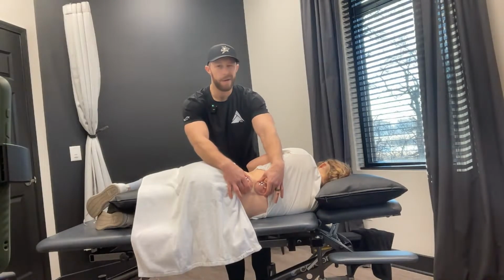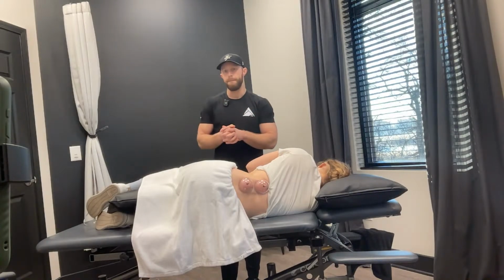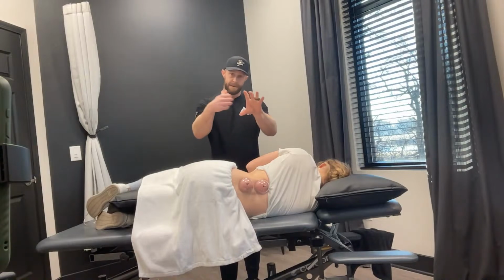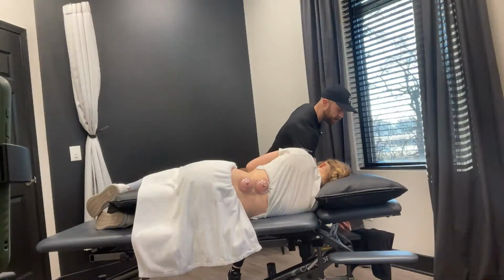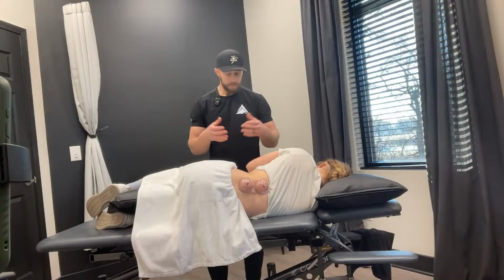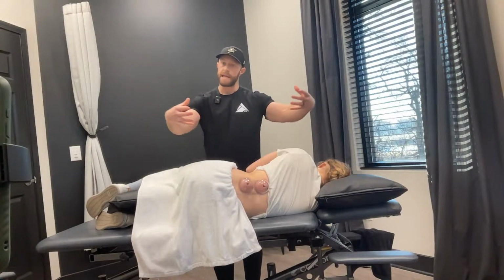These cups are probably only like 30 to 40% pulled out. So typically if I'm being more aggressive with cups, I get it a little closer to that full capacity of vacuum. But for this, I've got a very severe patient in front of me. They're very fear avoidant. They're not moving all that much. And I've just got a little bit of tension in those cups. I start out just like this, like you all are seeing. So the person just kind of gets comfortable, relaxes, feels that pull.